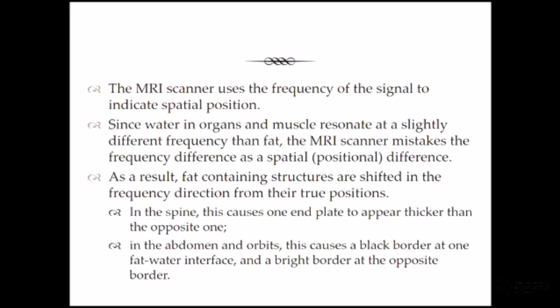And again, it's just one of those things where when you're scanning, you know that this is a possibility, you make adjustments to minimise the effect, or if you see it, you just recognise that it's an artefact and don't let it worry you.